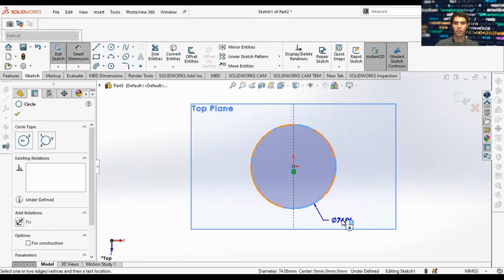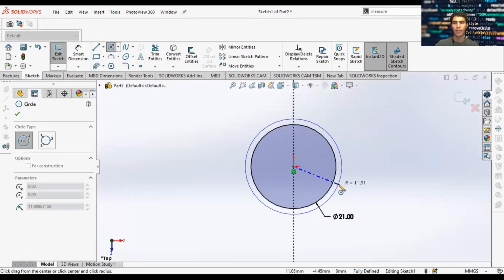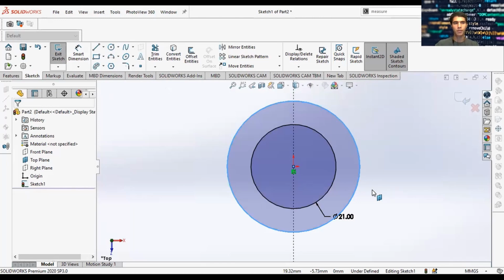And we'll go ahead and put in the required dimensions for this design, as provided to us in the PowerPoint: 21 for the inner annulus, and the outer annulus is around 26.7.